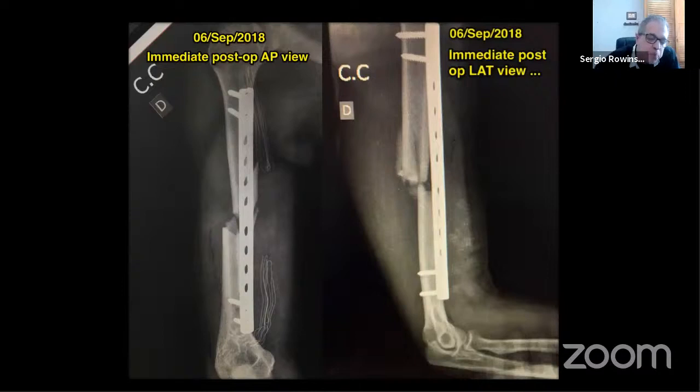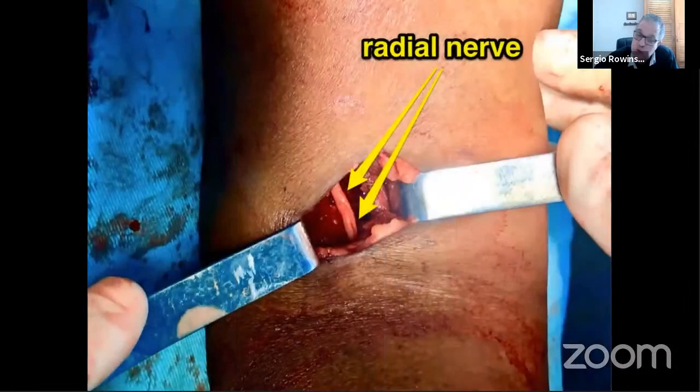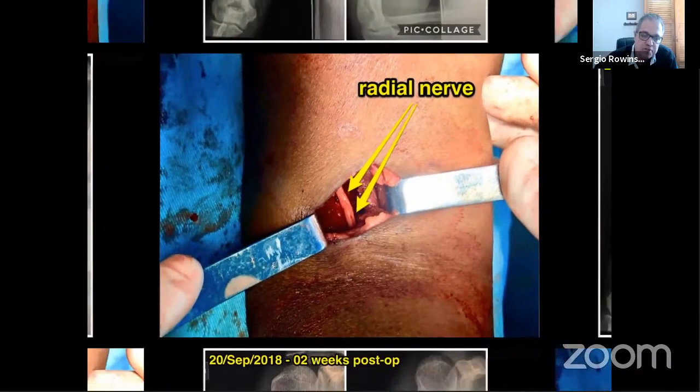I don't have the percentage, but in my opinion, as long as you have minimal contact in between bones, this is going to heal. But everything goes lower in very elderly patients from a radiographical point of view, not from a clinical point of view. So this is the radial nerve of the lady.